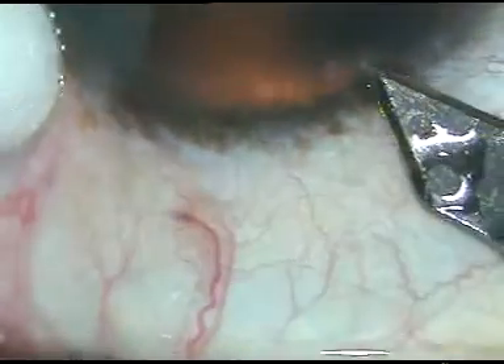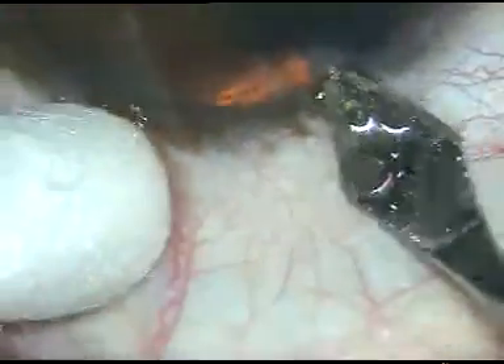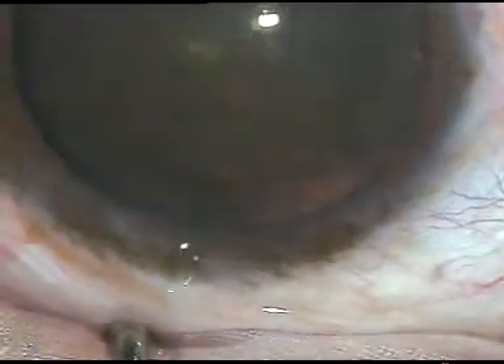Dear colleagues, this is phacoemulsification of a soft cataract. Let us see the surgical steps. This is the main incision, 2.8 mm. It's a posterior limbal incision.